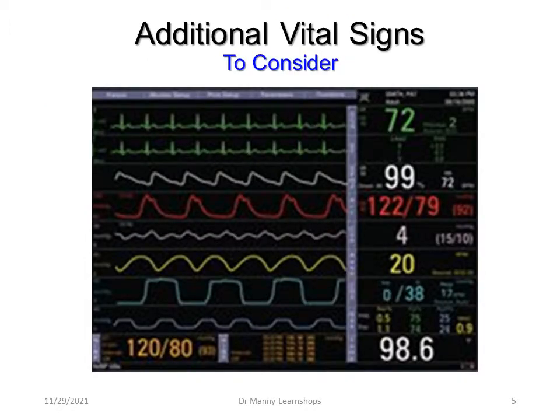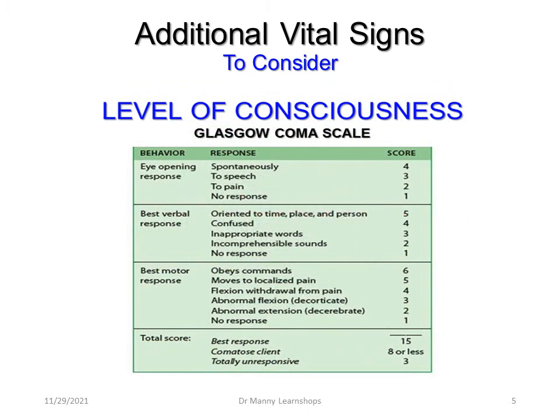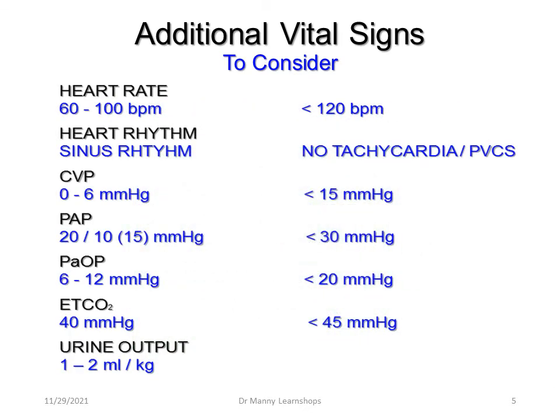Additional vital signs to consider are level of consciousness, preferably the maximum score 15. Additional signs to consider: heart rate 60 to 100 beats per minute, sinus rhythm, CVP between 0 and 6 millimeters of mercury, a pulmonary artery pressure of 20, diastolic 10, mean of 15, a pulmonary artery occlusive pressure between 6 and 12, end-tidal CO2 monitoring, capnography, 40 millimeters of mercury, a urine output of 1 to 2 mils per kg.